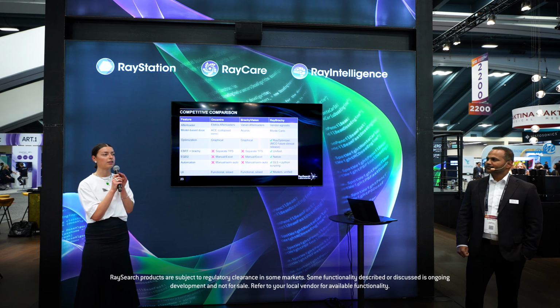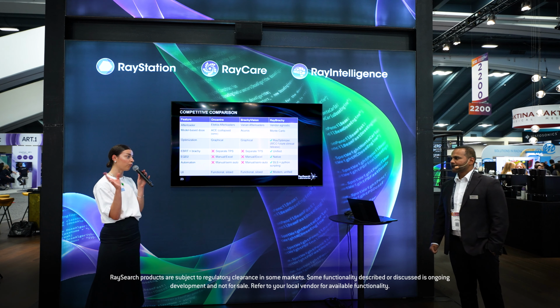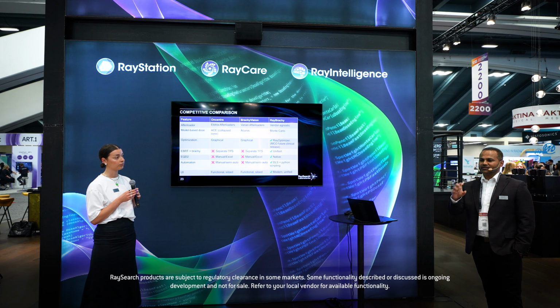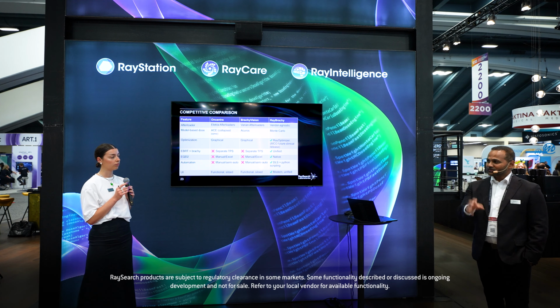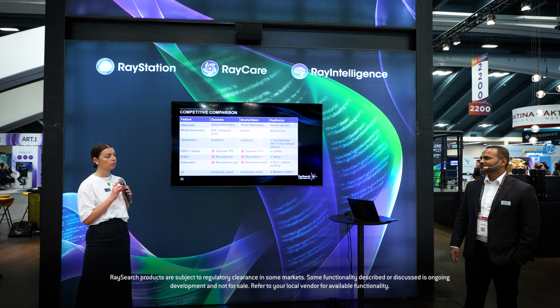And it also comes back to the very first talk that we had in our RaySearch webinars, and that was about automation. So you mentioned from 45 minutes down to 15. Yes. That is huge. Yeah, and as I mentioned, the issue with brachy planning is that the patients are in a very uncomfortable position. So we want to be able to treat them, get them out of the door. So having that turnaround of planning is gold.